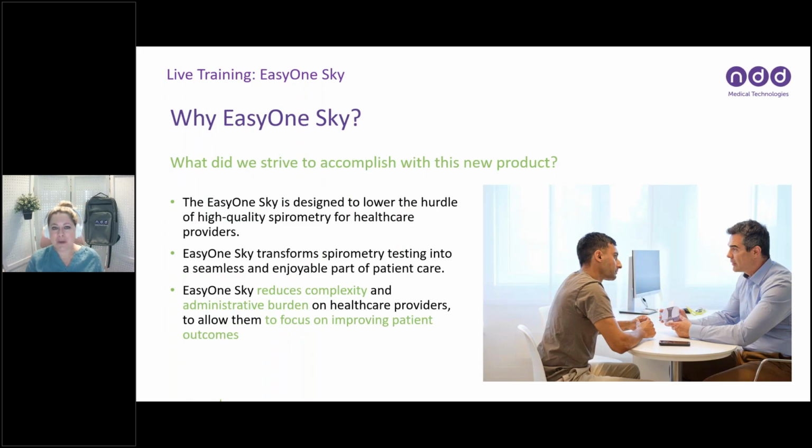All right, so jumping right into the EasyOne Sky spirometer, what did we strive to accomplish with this new product? The EasyOne Sky is designed to lower the hurdle of high quality spirometry for healthcare providers. One of the biggest things that we hear, especially from primary care physicians, as justification to why they maybe don't do spirometry is just the lack of training for their providers, and just the test can be difficult. So we really wanted to create a solution that anyone could pick up and use and get good quality spirometry results.